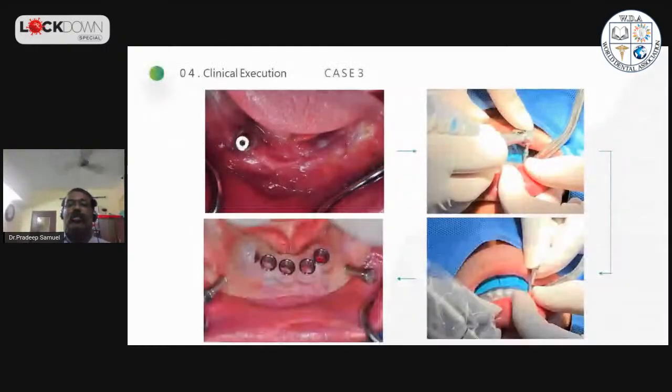These are the bone anchoring pins. Once we get the position, it will be easily removable because there is no holding mechanism. To place it, we screw a pin into the bone. That is, we have a small 1.5 mm drill. We pass it on to this.